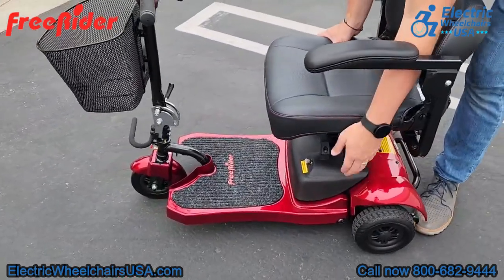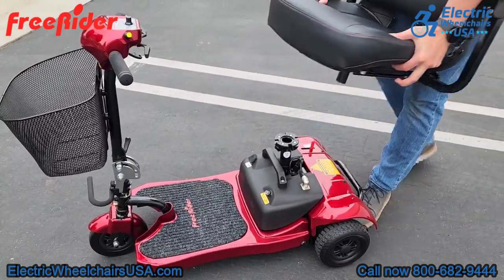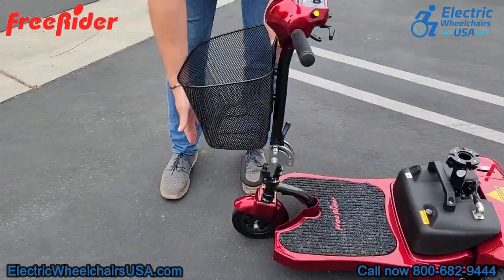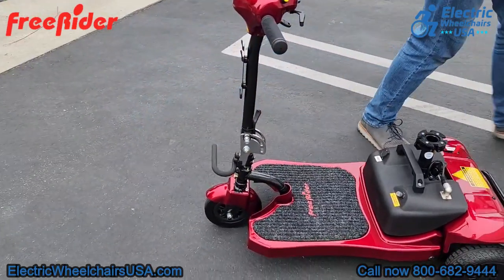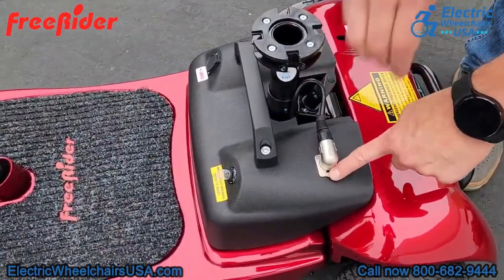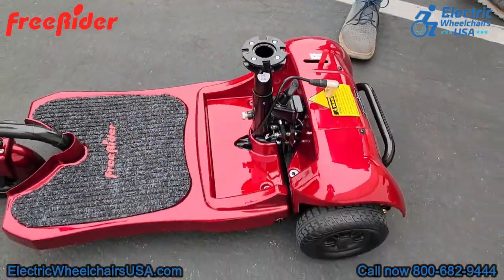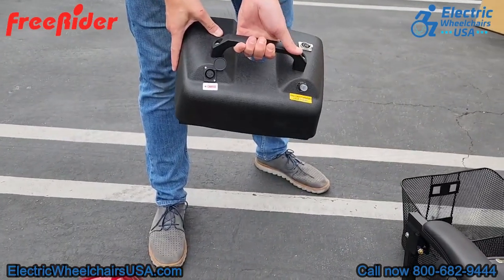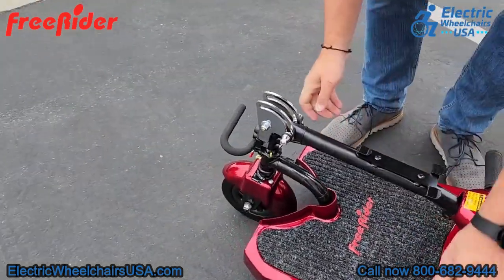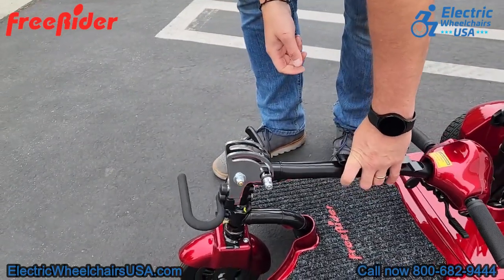To disassemble the scooter it's a few simple steps. First, you remove the seat by lifting up that lever that swivels the seat — that will pop the seat off the seat post. Next, remove the basket. After that, unplug the battery pack — there's a cord that connects to it, and you press a small button to release the cord. Then adjust the tiller all the way down so it's about level to the floor board, and lock it into place.